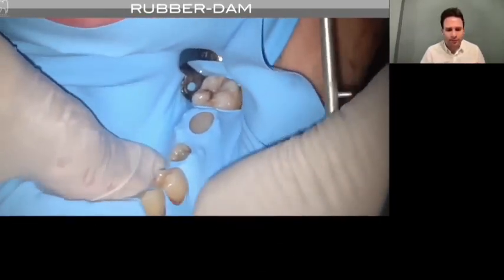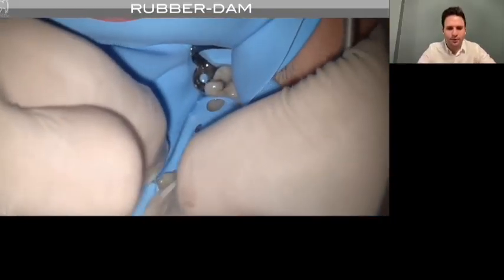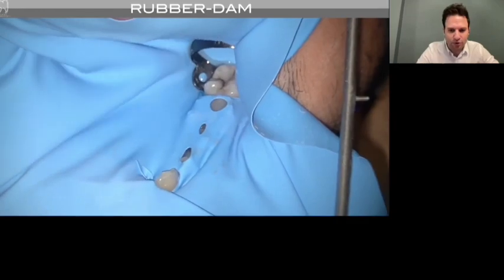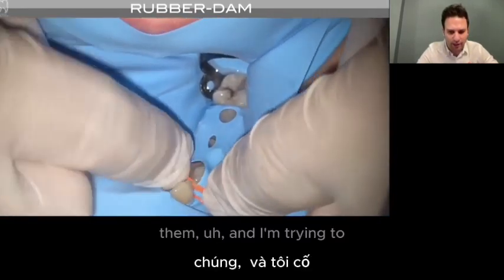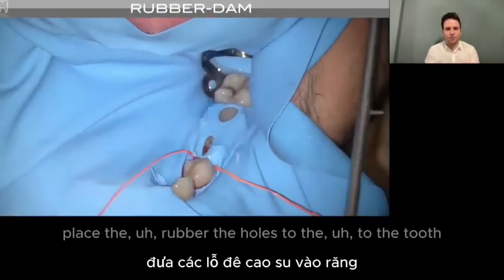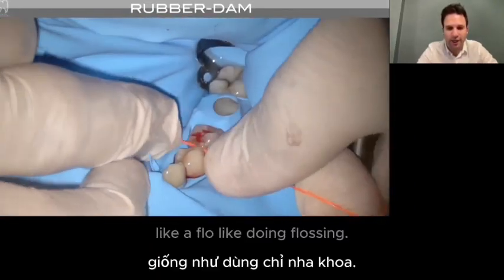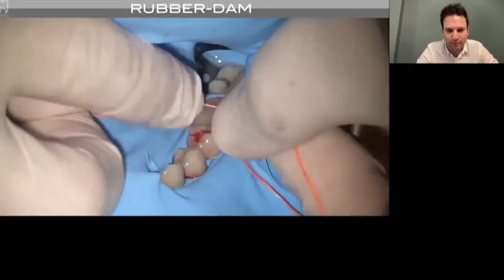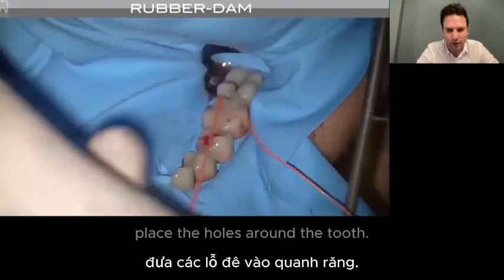Then I'm using my fingers to push them, and I'm trying to place the rubber dam holes around the tooth like doing flossing, and with dental floss you can directly place the holes around the tooth.